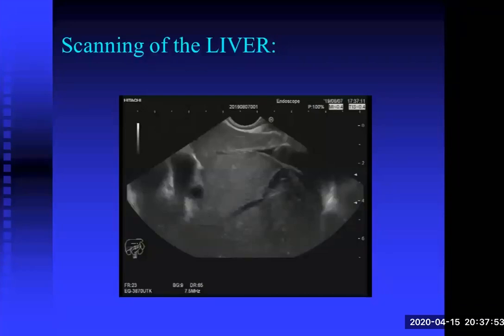It is very nice because it gives us very nice information about the intra-abdominal structures, and became a very important examination. Why? Because if there is gastric outlet obstruction, whether due to benign causes such as peptic ulcer disease or malignant causes, you can't go to the duodenum. So you should do the whole job from the stomach.